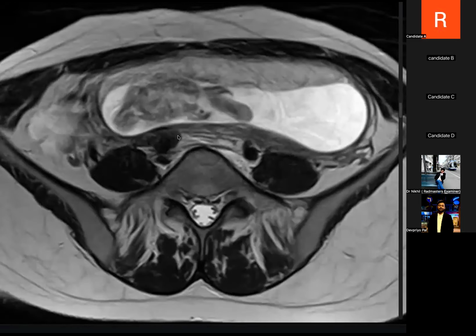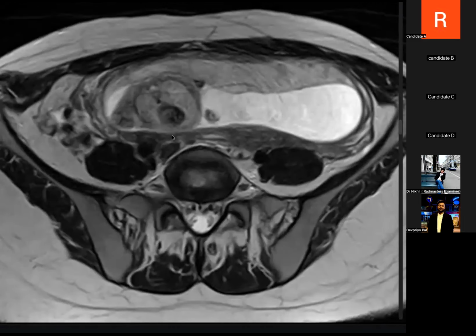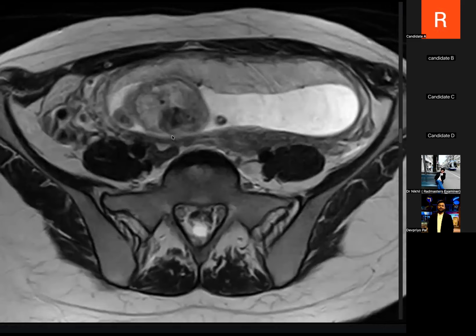Yes. Okay. So what features favor dermoid cyst on ultrasound? Dermoid cyst, I would like to see a dot and dash sign, and also a Rokitansky nodule would be there. And sometimes the tip of the iceberg sign, and a tooth-like appearance.